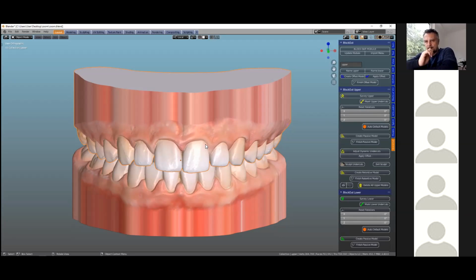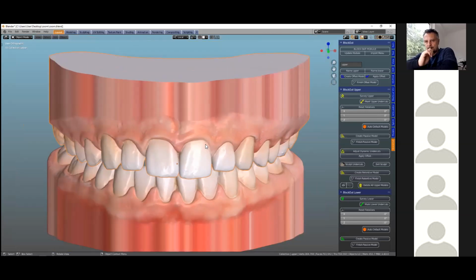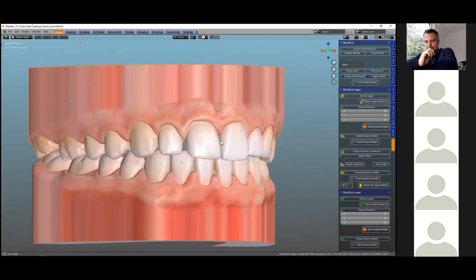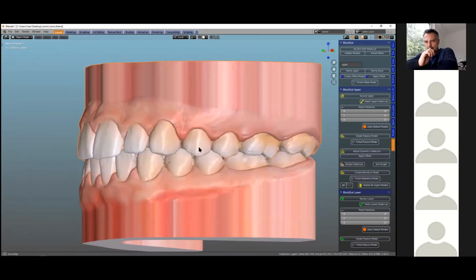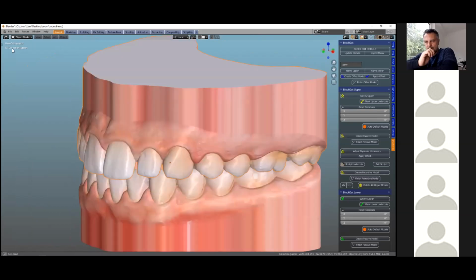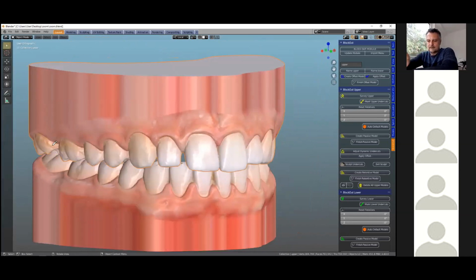So sometimes we don't have retentive undercuts like you can see here. We are kind of void of undercuts. So you probably don't want to fall in the habit of taking your splint halfway up the tooth surface, because we need enough tooth surface. We've got to grab hold of all the area that we possibly can. Yeah, we'll discover that as we go, I think.